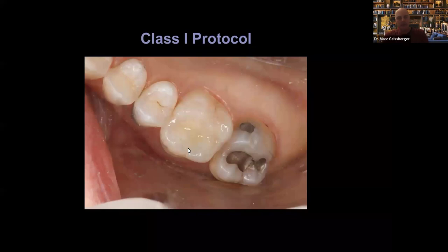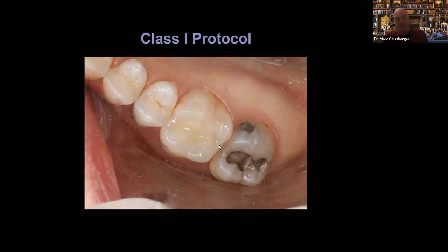Now, here's the trick, knowing anatomy. High spot, high spot, high spot, high spot. There are four high spots on an upper molar or a lower molar, doesn't matter, and three low spots. Low spot distal fossa, central fossa, mesial fossa. So the tip here is remember your 4-3 rule with all molars. Okay, this amalgam actually demonstrates it quite nicely. High spot, this should be triangular ridges, same height as the marginal ridges. Oblique ridge, marginal ridge. Low spot, low spot, low spot.